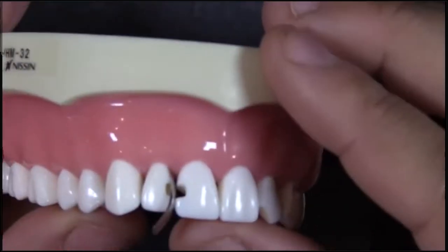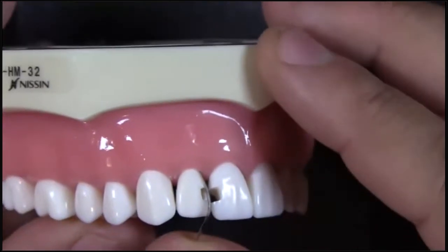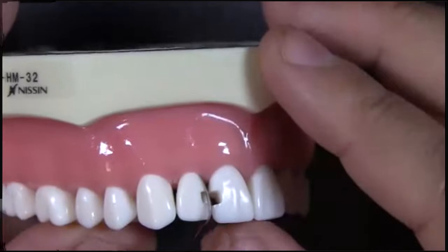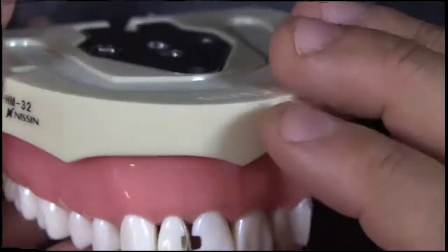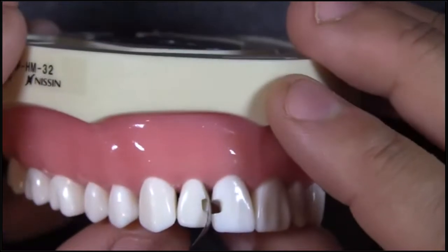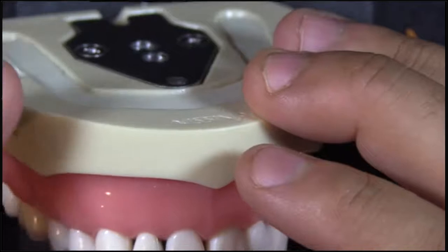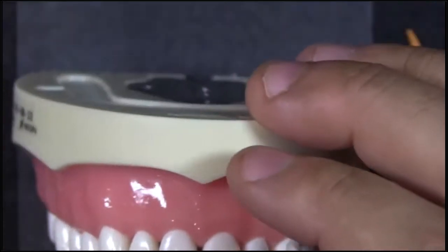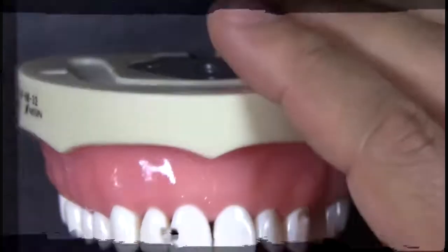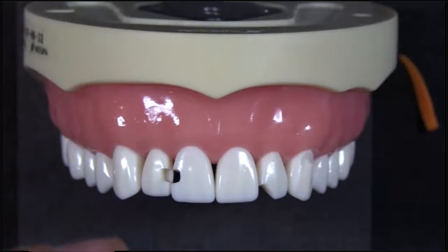So I could restore that tooth like that, and that's going to lead to a pretty good result there. It matches the curvature of that tooth pretty well. In the past, I used to do that because I wanted to get that curvature. I didn't want to have problems with that curvature. Now, after the fusion system came out, not so much, just because I could do both of these at the same time using these fusion bands. So this is what they look like.